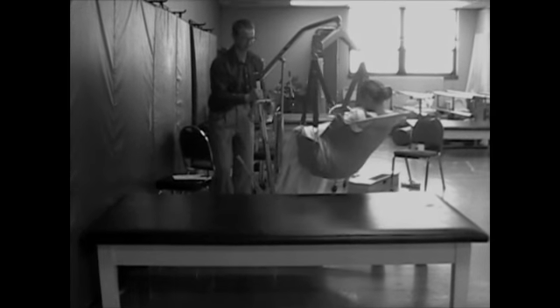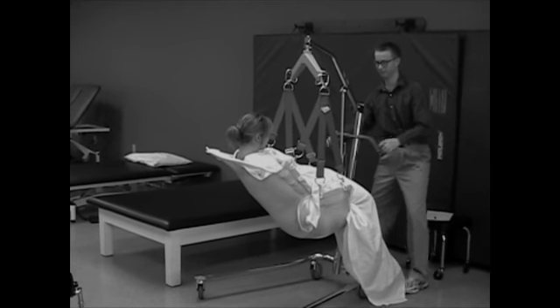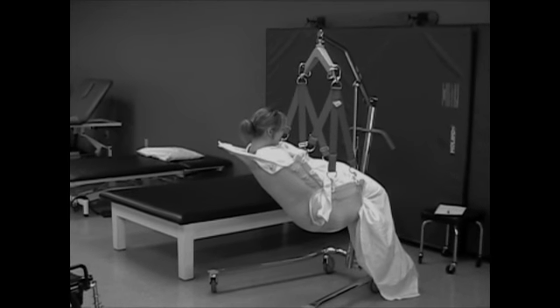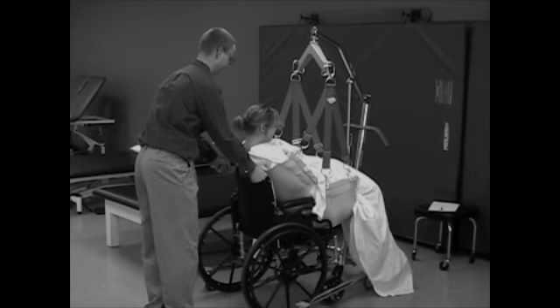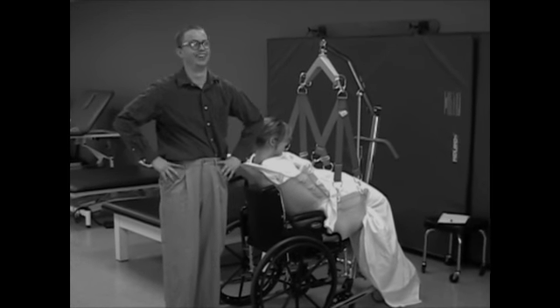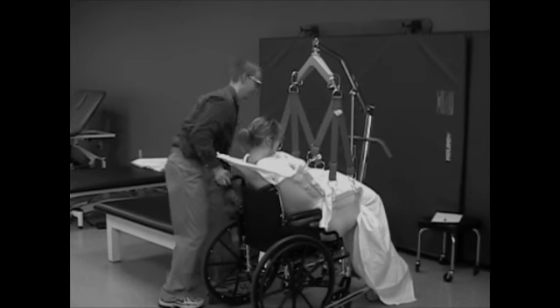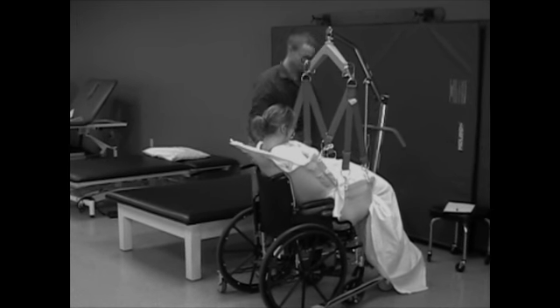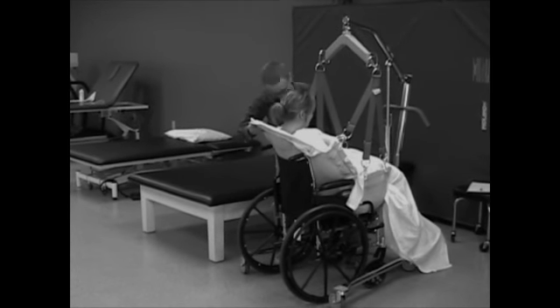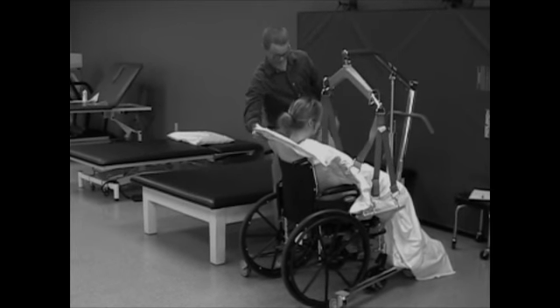Super, Mr. Pomperbottom. Now simply grab the legs, swing the patient over, and let the support of her own weight fall into the hydraulic lift. Go ahead and swing her around and get her in position for the wheelchair. Make sure you tell them that you'll be right back. Slide the wheelchair in between the base, right underneath the patient. What about those brakes? Ha ha, there you go. Now that the wheelchair is safely secure, it's ready to lower the patient. Just release the hydraulic valve and lower the patient. Help guide the patient in and make sure that their back is firmly in the wheelchair. There you go, Mr. Pomperbottom — easy as pie.